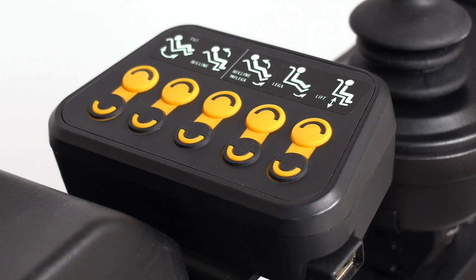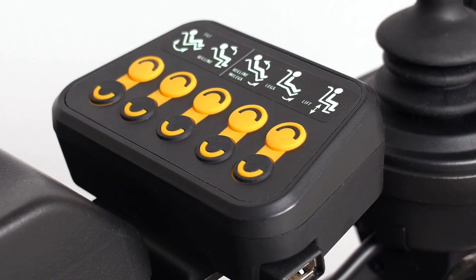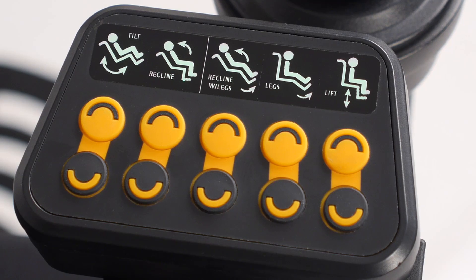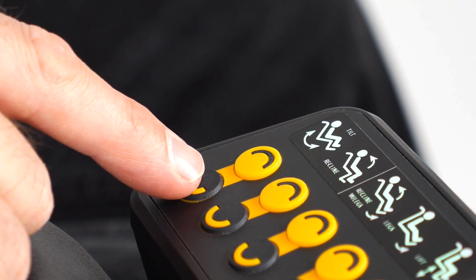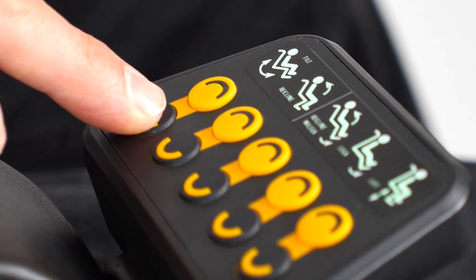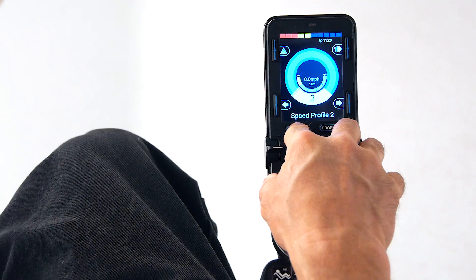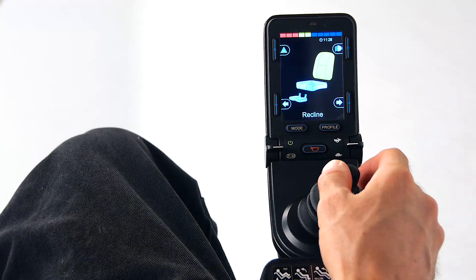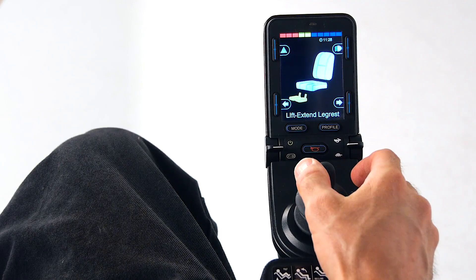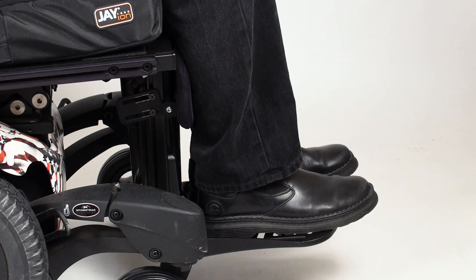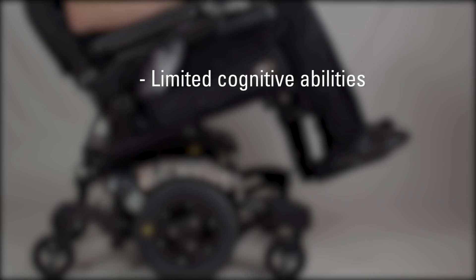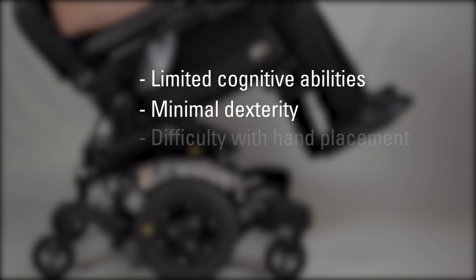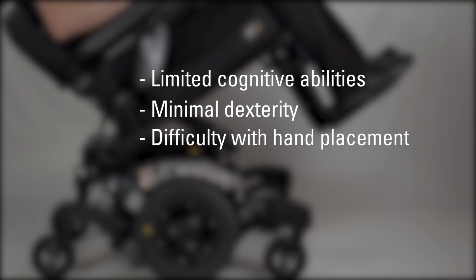Welcome to the new Quickie Control-5 Direct Access Switch box. You may be wondering, what exactly is a direct access switch? In simple terms, it's any button or toggle switch that provides direct access to a chair function that would normally require moving through an elaborate menu system to initiate. For example, a direct access button might independently control power tilt. This ability to activate functions without using a joystick is very helpful for users with limited cognitive capabilities, minimal dexterity, or users that have difficulty moving their hands from one location to another.